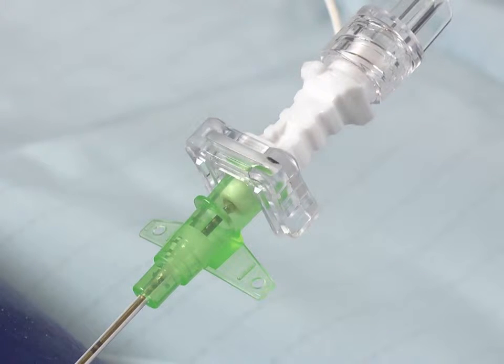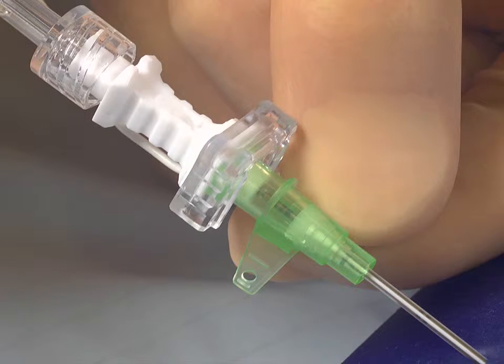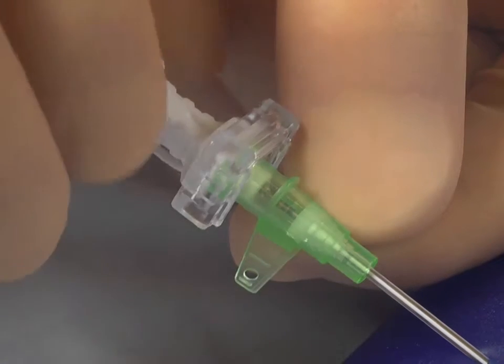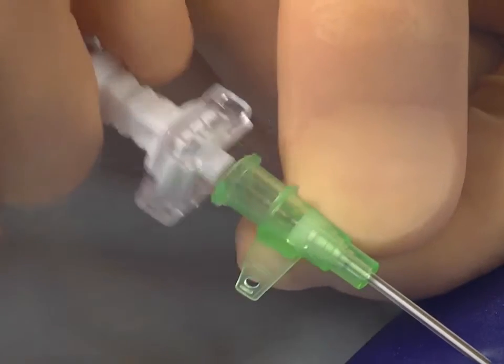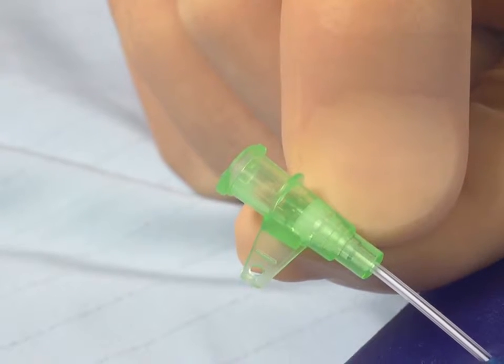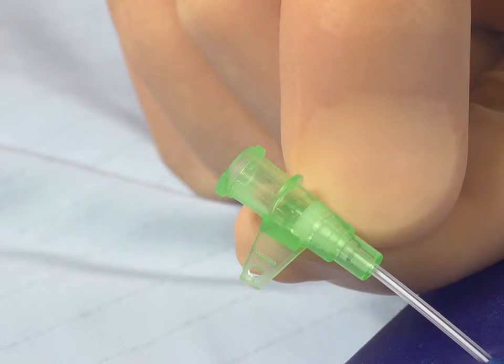Some newer versions of the E-catheter contain the fixed clip, which connects the outer sheath and the Sonoplex needle together. In order to remove the needle from the sheath, you must twist the needle 90 degrees clockwise or anti-clockwise before it will detach, as demonstrated.